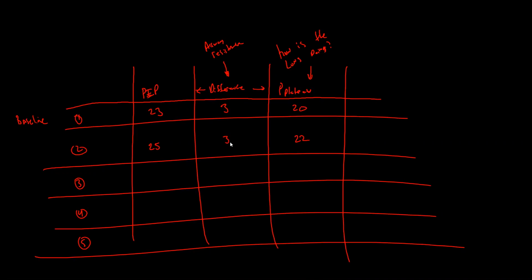Okay. Tamisha, do you know why that's the case? Not really, but I would have to go with because of the increase in the PIP. Okay. Not because of the PIP. It's because of the plateau pressure. Oh, okay. So when we come back to our equation on compliance, remember it's volume over pressure.